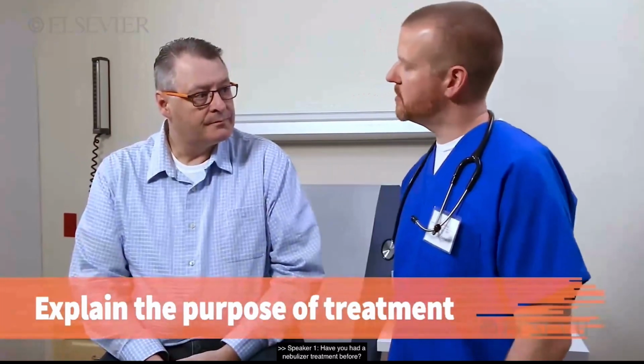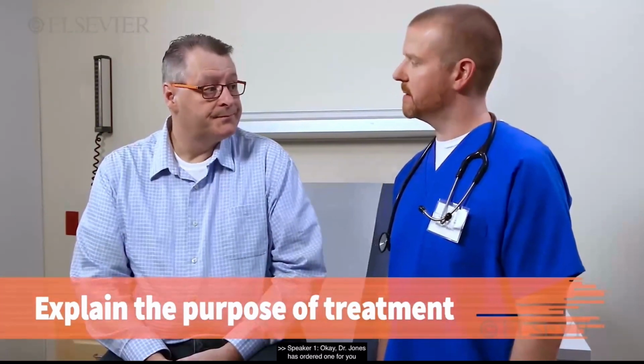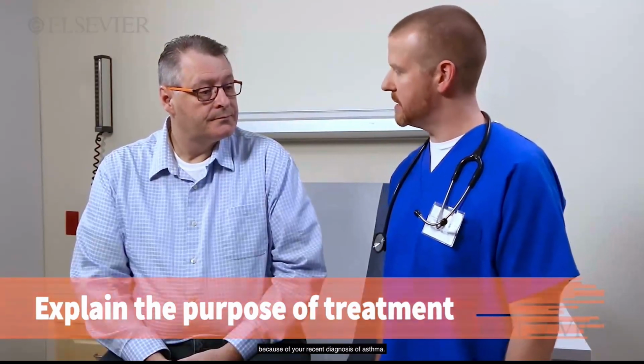Have you had a nebulizer treatment before? No, I have not. Dr. Jones has ordered one for you because of your recent diagnosis of asthma. It's not a painful procedure. I'm just going to use the sanitizer, set up the nebulizer, and we'll get rolling on that.